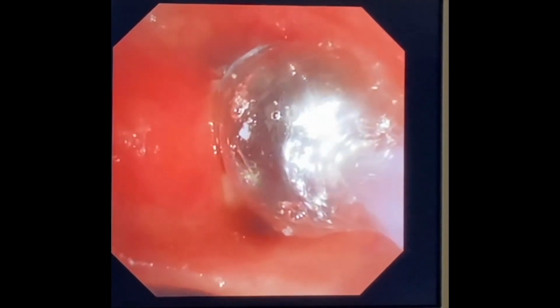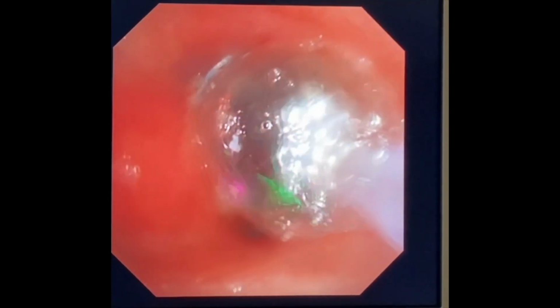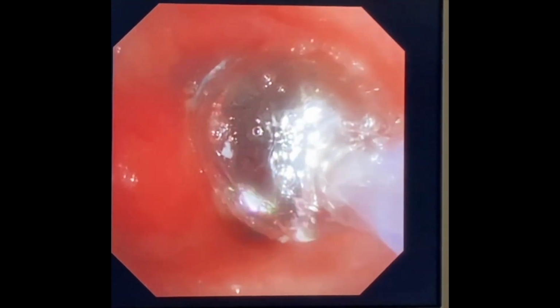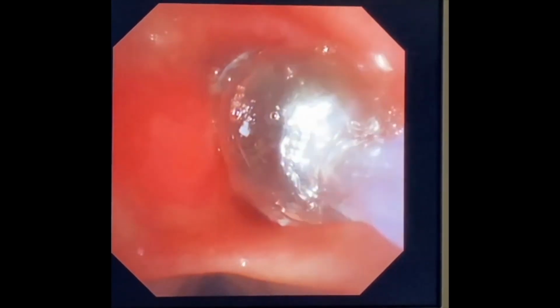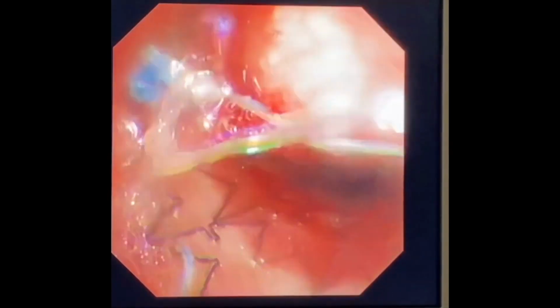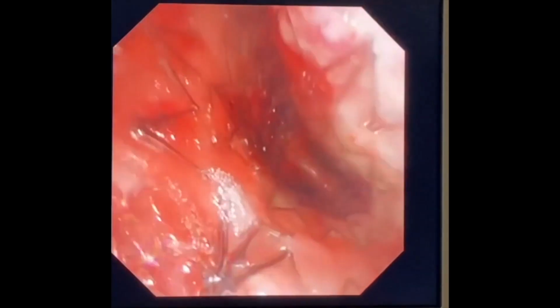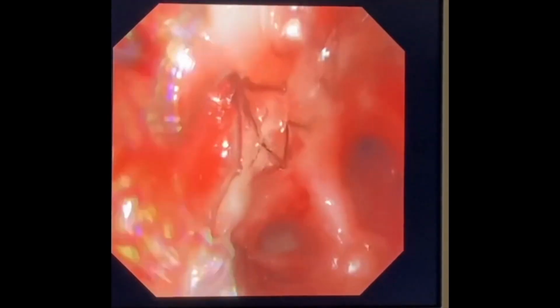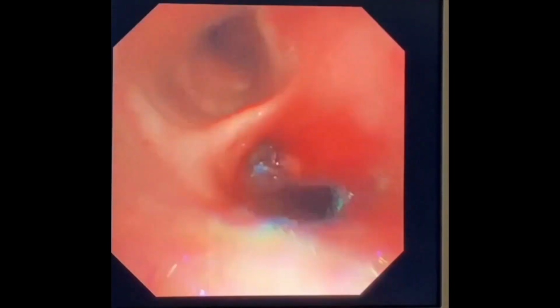As the stent warms to the body temperature, it will expand similar to esophageal stents over the next 48 to 72 hours. However, in this case, we do want to make sure that we can see the distal end of the stent has opened in an appropriate position. The balloon dilatation allows us to do this and pass the bronchoscope through the stent, and confirm that the distal end of the stent has opened up in the perfect position where the left upper lobe and left lower lobe divide.